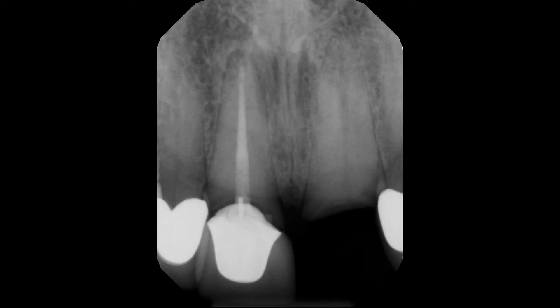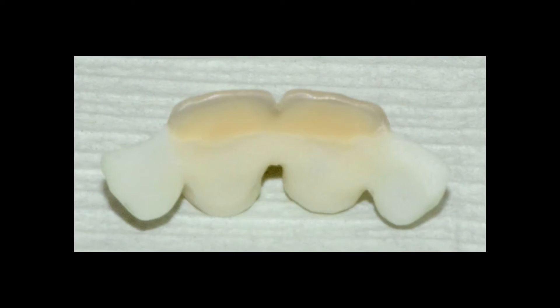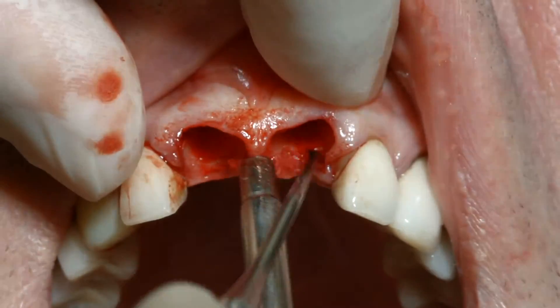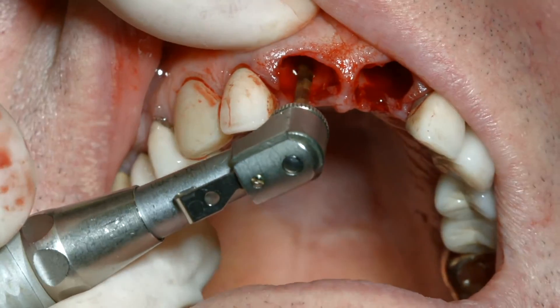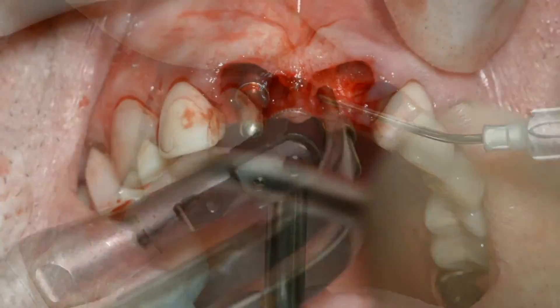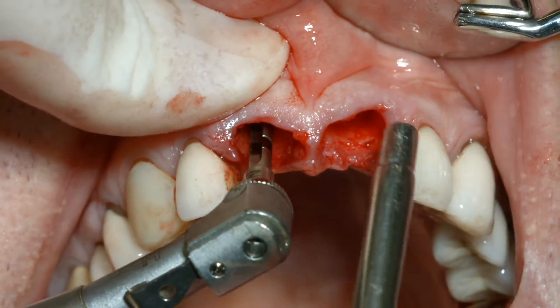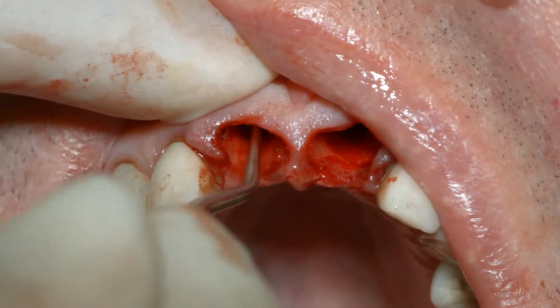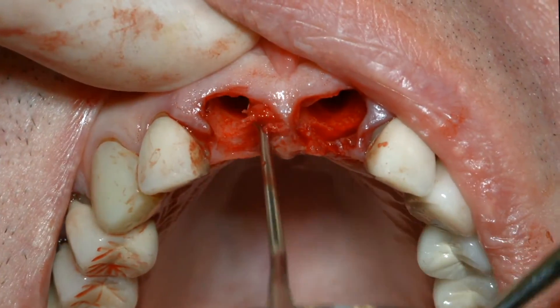The treatment of our second patient, a 68-year-old man, began with the laboratory fabrication of a TRINIA and ceramage transitional stabilizing prosthesis and the extraction of his two maxillary central incisors. After confirmation of the trajectory of the initial pilot osteotomies with gold-colored paralleling pins, the osteotomies were incrementally widened with latch reamers. A spoon excavator was used to confirm the integrity of the osteotomies' walls and to collect bone chips.